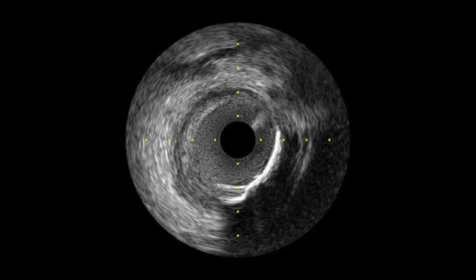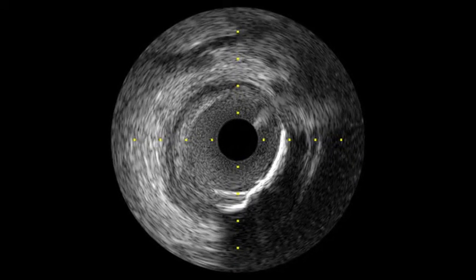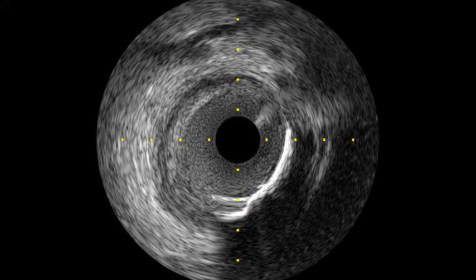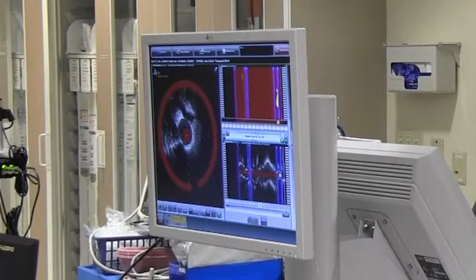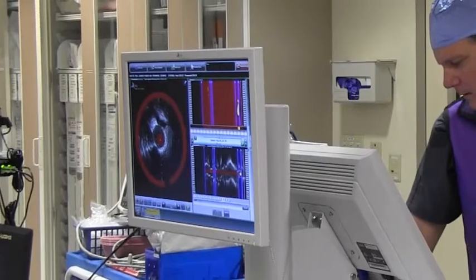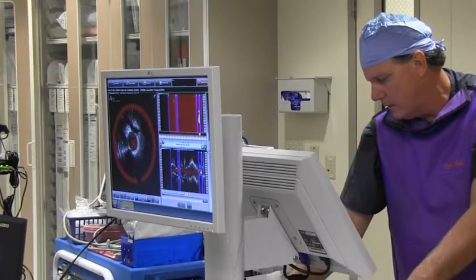The nice thing about intravascular ultrasound is that you can see plaque, you can see whether it's ruptured, you can see whether it's ulcerated. The downside is a lot of times you can't see any of that, and so you haven't necessarily ruled out a problem. You might see overall plaque burden. We chose to use the TVC imaging system largely because my thought was that there was probably going to be an area that had lipid core plaque.